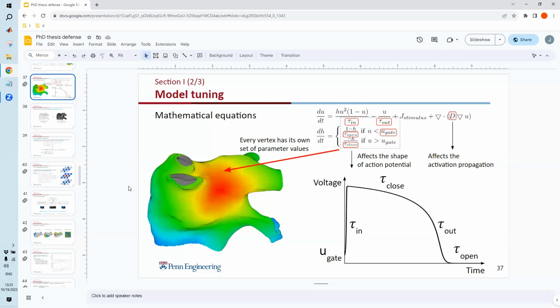For the voltage map, we do need to compute the electrogram. When we have the electrogram computed, then for each of the points we can compute the range of that electrogram, which will be the magnitude, and that value is converted into a voltage map.